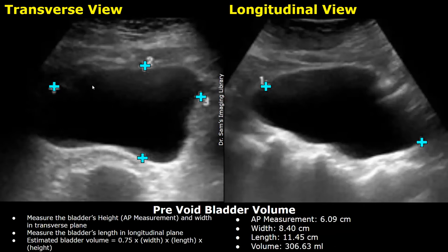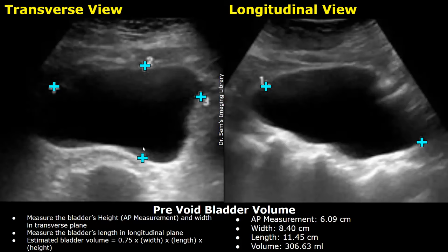These are images of a full bladder before urination. This is a transverse view, and this image is in longitudinal view. After obtaining the transverse view of the bladder, you can place two calipers: the first caliper is placed at the anterior wall of the bladder and the second caliper is placed at the posterior wall. Take the largest measurement you can find in the image — this is the anterior-posterior or AP measurement, also called the height of the bladder.